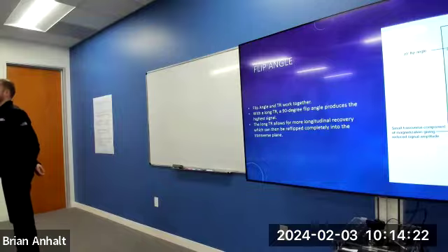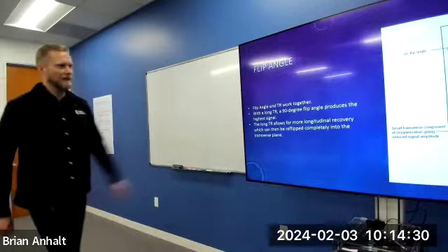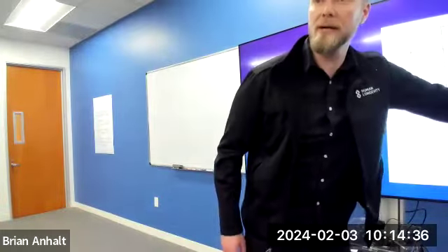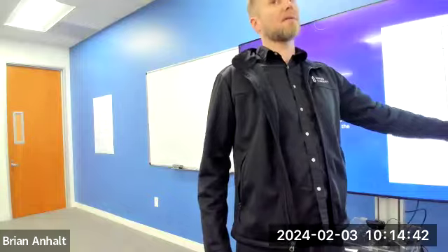Making sense? So with a long TR, what flip angle is going to give you the most signal? 90, right? Because if I only flip it a little bit, let's say a 30-degree flip angle, look at my transverse magnetization. It's not as much as if I flipped it all the way to 90, right? So if I have a long TR and I only flip it 30 degrees, I'm not going to get as much SNR.